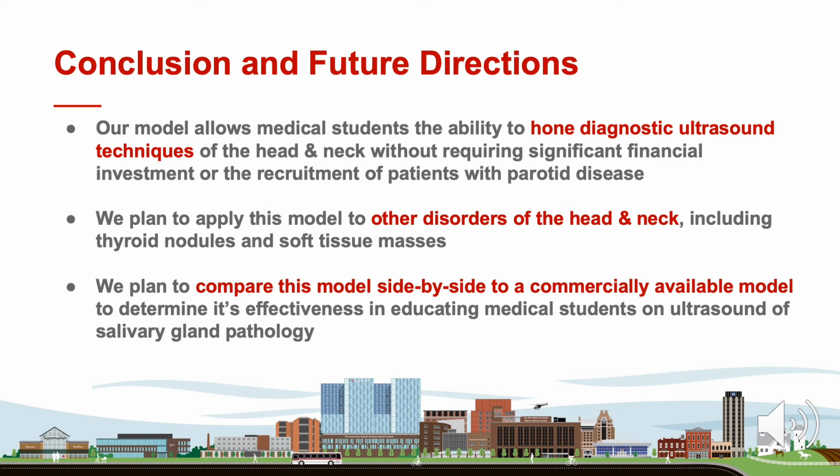The nitrile glove setup filled with water we found to be a great representation of cystic lesions as well as other salivary glands. And so taking that setup and applying it to other disorders of the head and neck should prove fruitful for future studies.